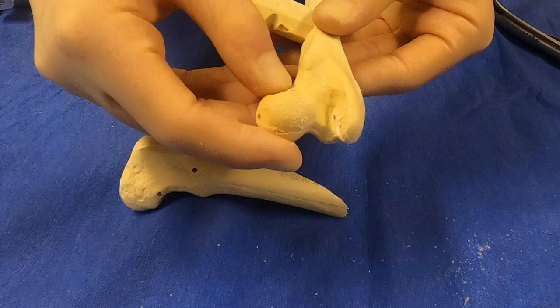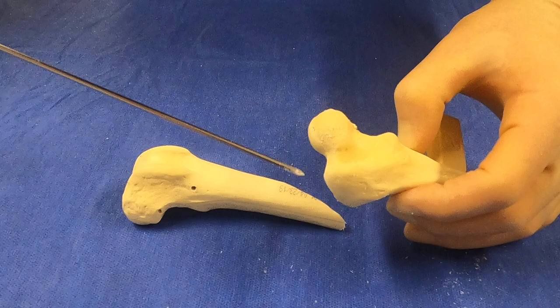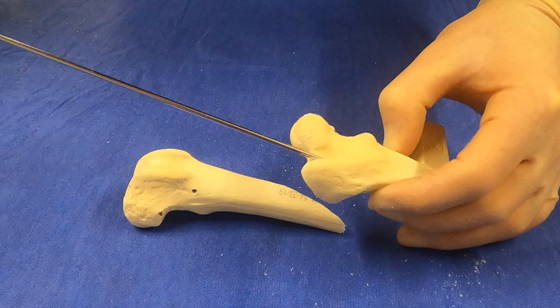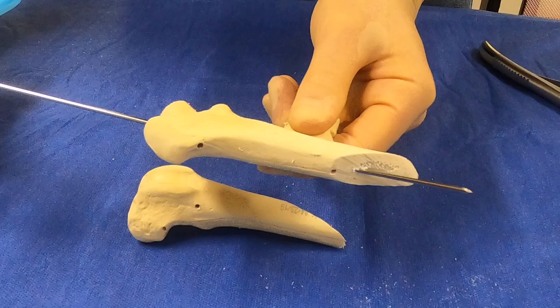The ideal place to place a pin in the femur is the intertrochanteric fossa. We can do that normograde relatively easily by coming through a small skin incision and walking off the greater trochanter medially to get into the intertrochanteric fossa, then coming down.